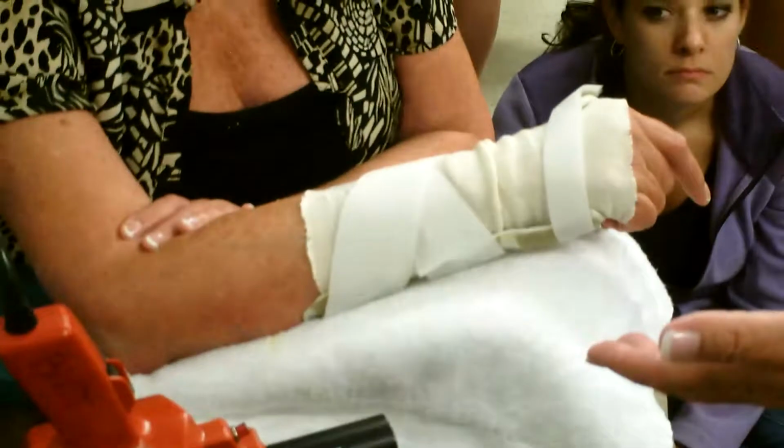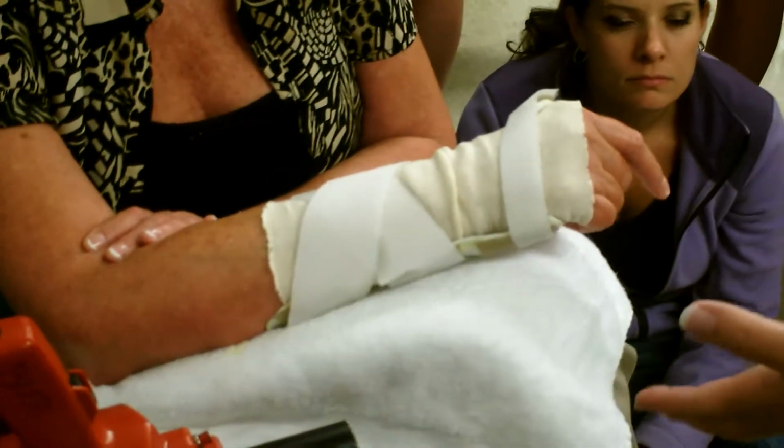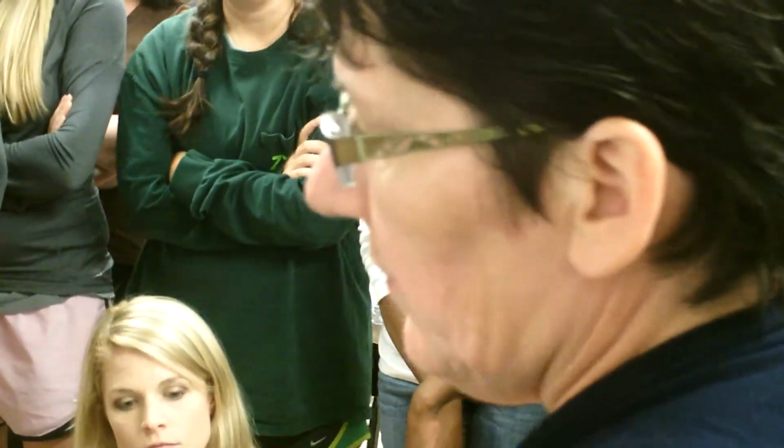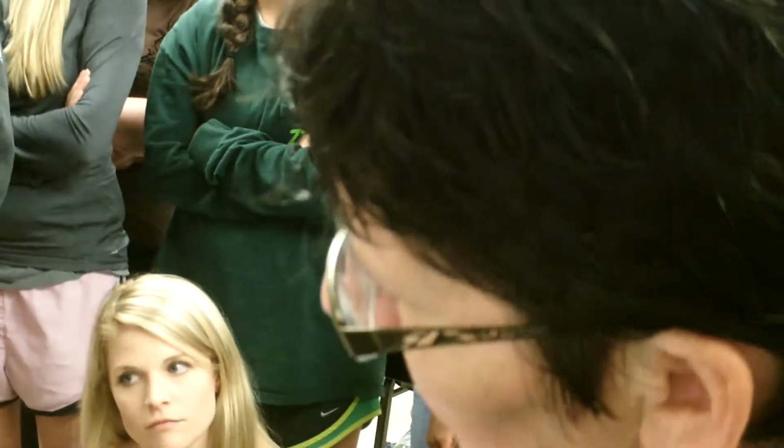It's not a problem. Sometimes you're swollen when you come in today, and then tomorrow you're not swollen and the splint fits differently. So it is no problem to just call the office and make an appointment and come back in. You're welcome. Do you have any questions? No, I think you answered them all. Would you mind repeating back the instructions for me that you heard?